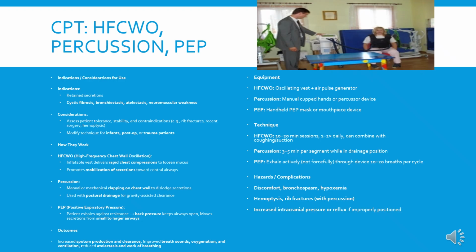In the outcomes, you're looking for increased sputum production and clearance, improved breath sounds, oxygenation, and ventilation. For technique, HFCWO, 10 to 20 minute sessions, percussion, 3 to 5 minutes per segment, PEP, exhale actively, not forcefully, through device, 10 to 20 breaths per cycle.